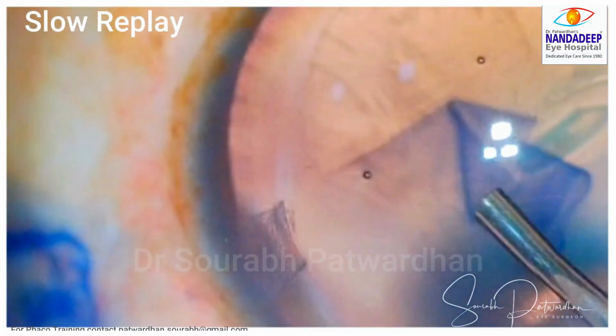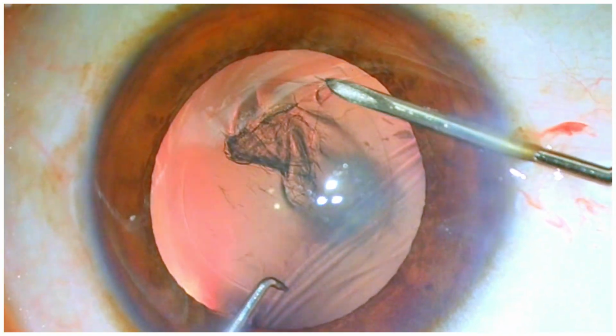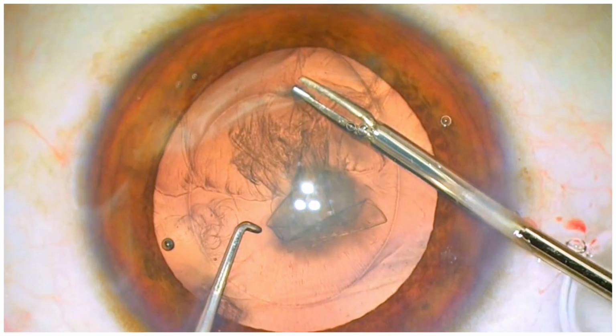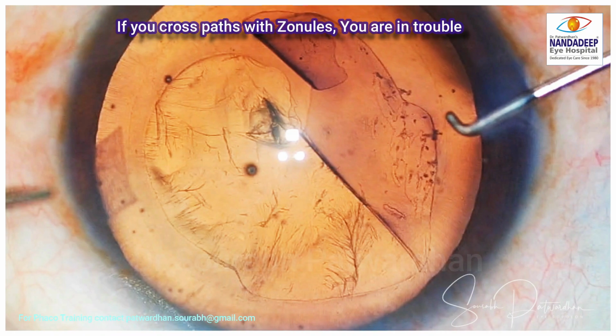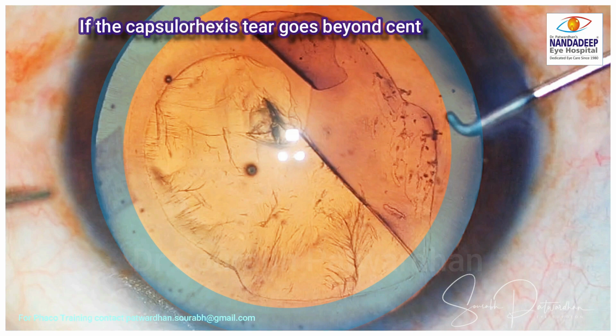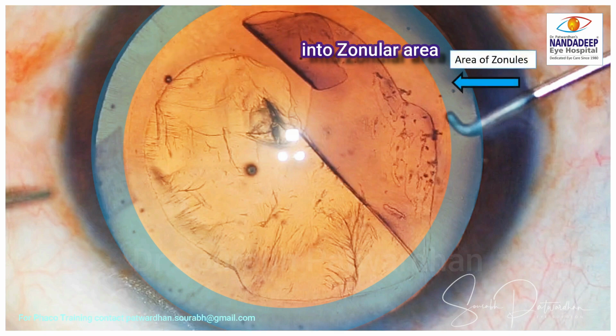So how to avoid that? Let's see, and let's understand the rules of the game. It's best to avoid crossing path with the zonules. Whenever the capsulorhexis goes beyond central 6.5 mm, it is likely to cross into zonular area, and once the tear is in the zonular area, there is a high chance of extension beyond the lens edge.